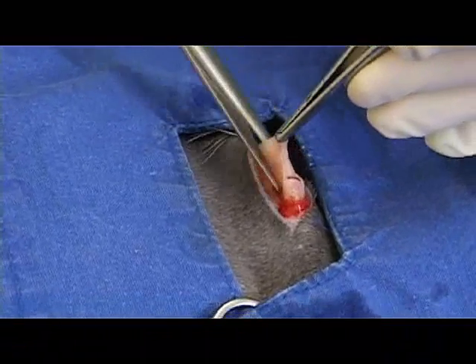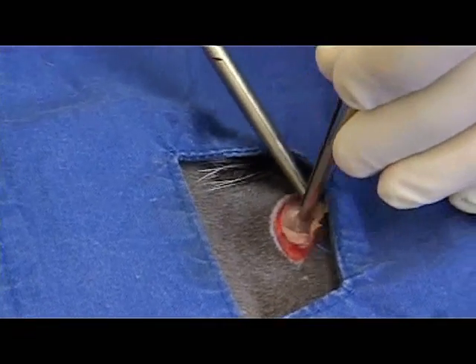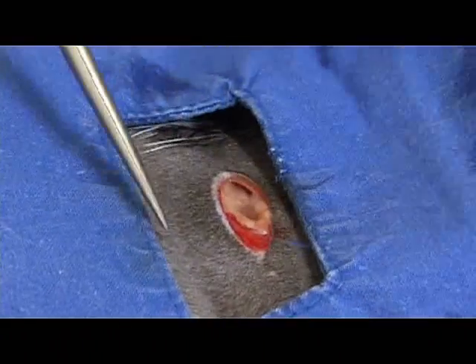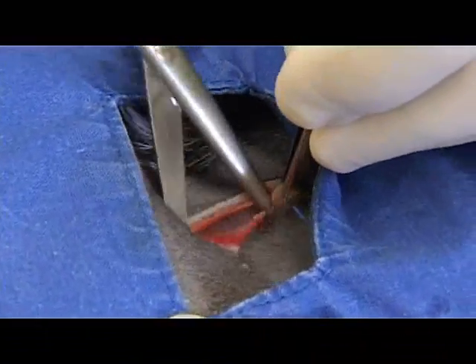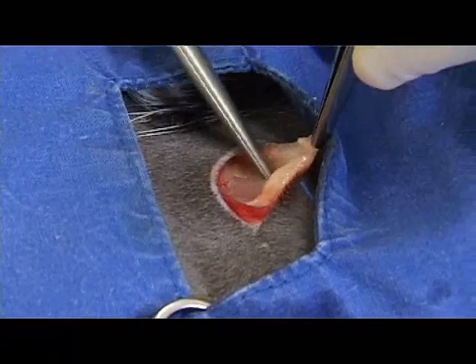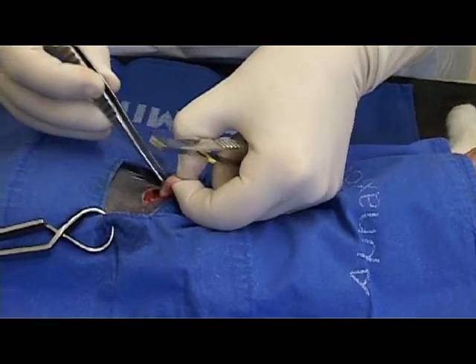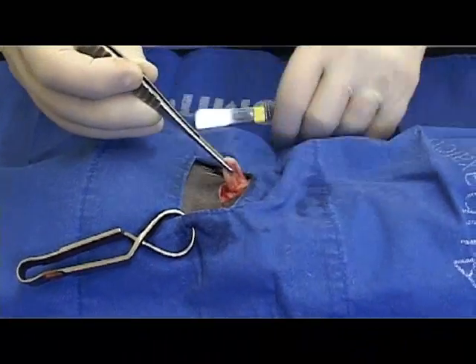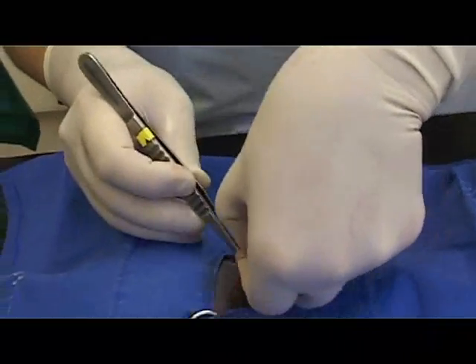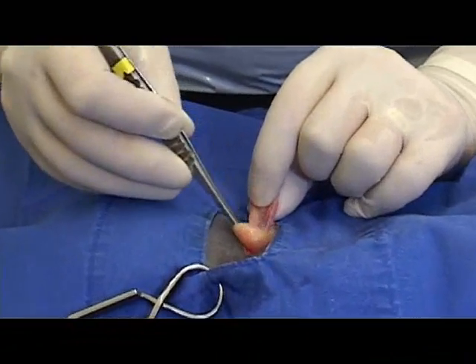Through the skin. A bit of a fat layer. And through the abdominal wall muscles, which there are several layers. The uterus should just be lying here. I haven't quite got it through like that. Two layers. Because she's had kittens, it's all a bit bigger and baggier than it might be. She had 5 kittens 12 weeks ago. So it's a good enough reason for spaying her.